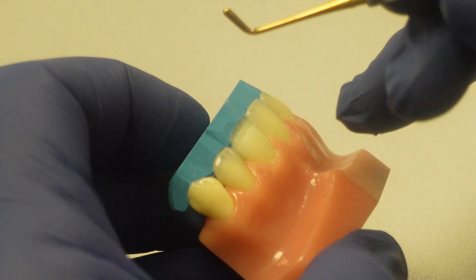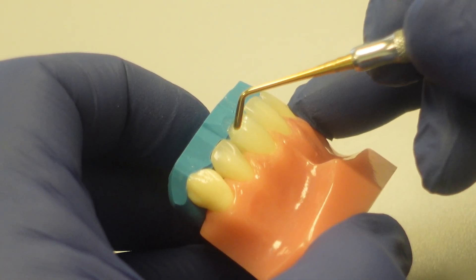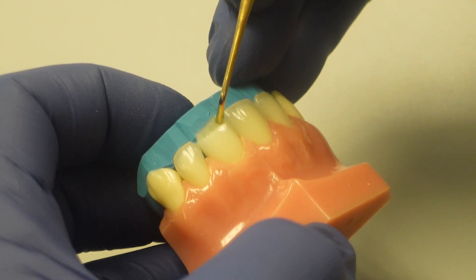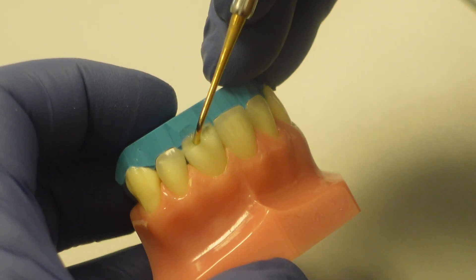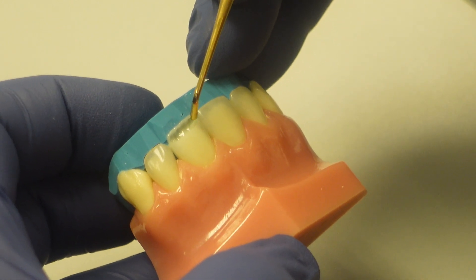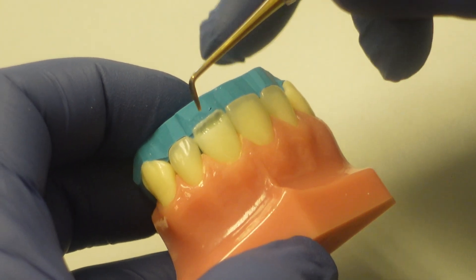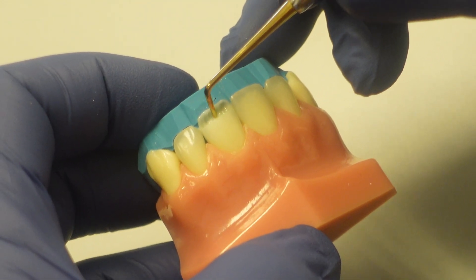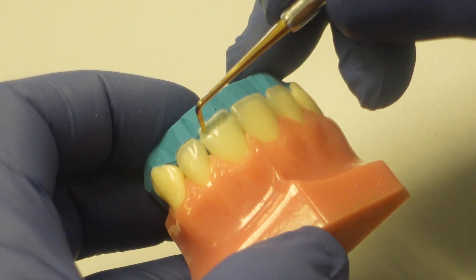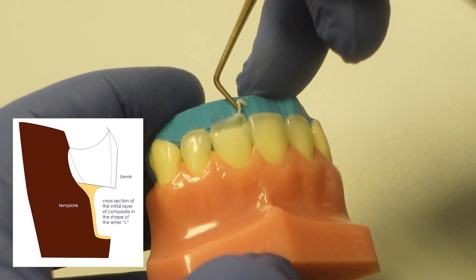Now I'll demonstrate how I make this layer the proper thickness, which should be quite thin. So now that it's adapted to the tooth, I'm going to push in from the facial here, trying to make this layer thin but not paper thin. I don't want it so thin that it would easily break if I accidentally bumped my instrument into it later. So I can cleave off a little excess quite easily. In cross-section it would look like the shape of the letter L — thin, but not paper thin.